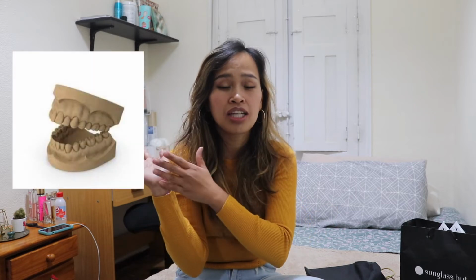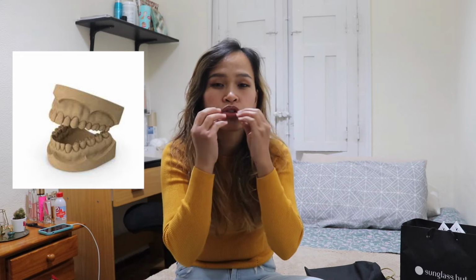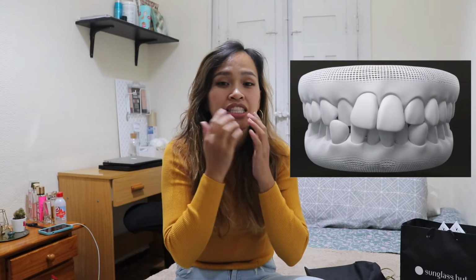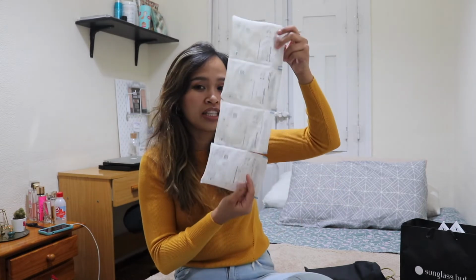With the old type of braces, they take molds to get the shape or the positioning of your teeth. But with Invisalign, it's all digital. They have a scanner. First, they scan your entire mouth and do a study, and after that they make your liners, like these. Examples of these liners are these.